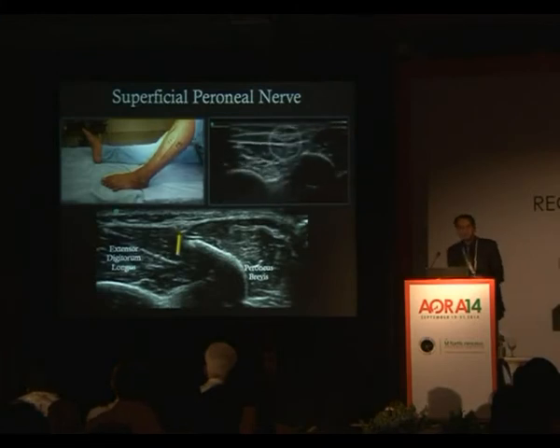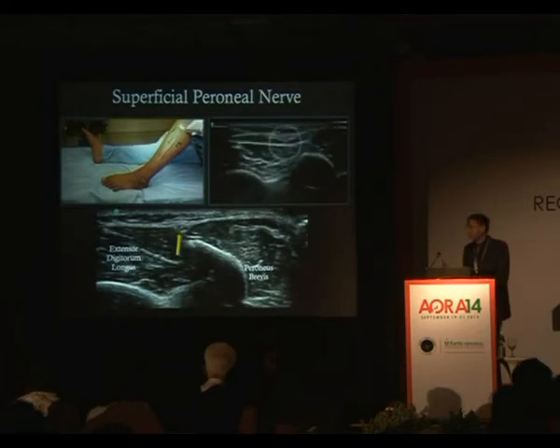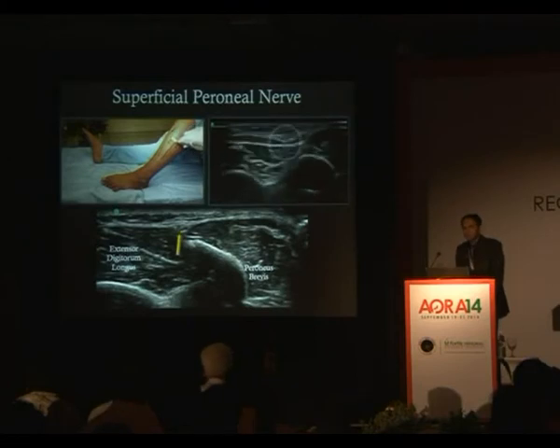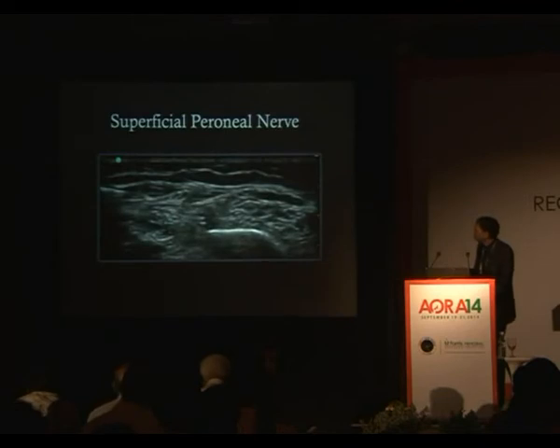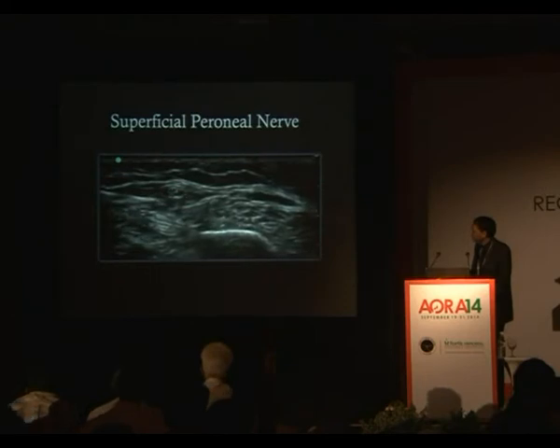By the time it reaches the ankle, it's gone almost subcutaneous, and that's how the technique is described for an ankle block with the superficial peroneal nerve. You're just going to do a subcutaneous injection. To see a block, you can see the tendon of the peroneus longus, the peroneus brevis, extensor digitorum longus, and you can see the nerve here, just under the fascia.